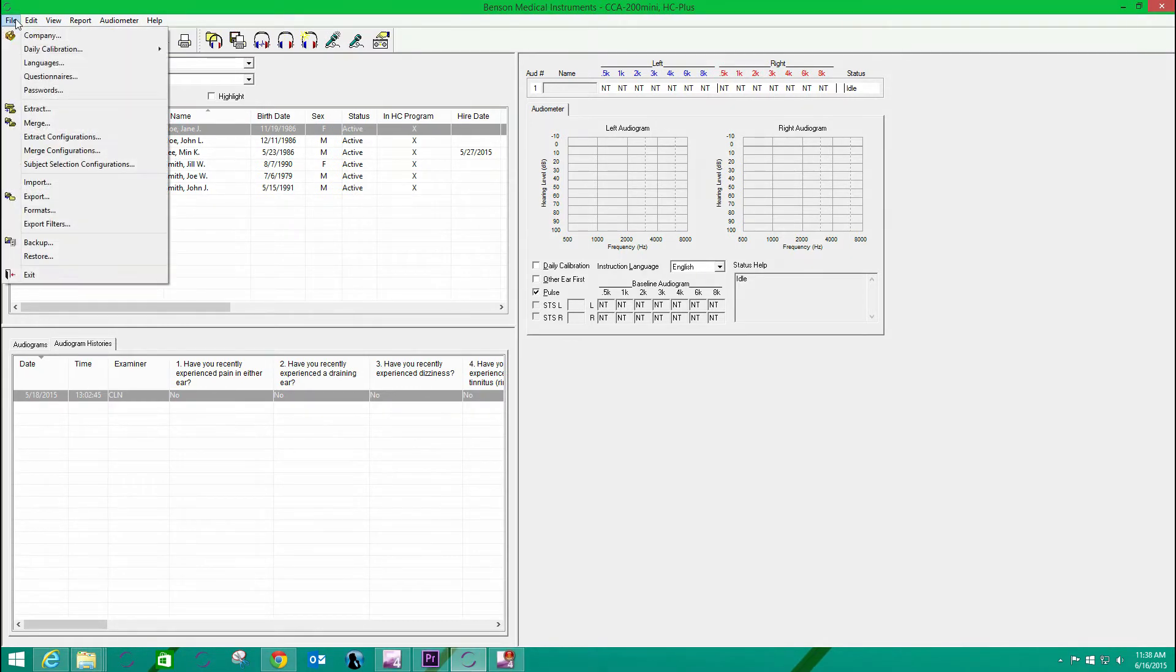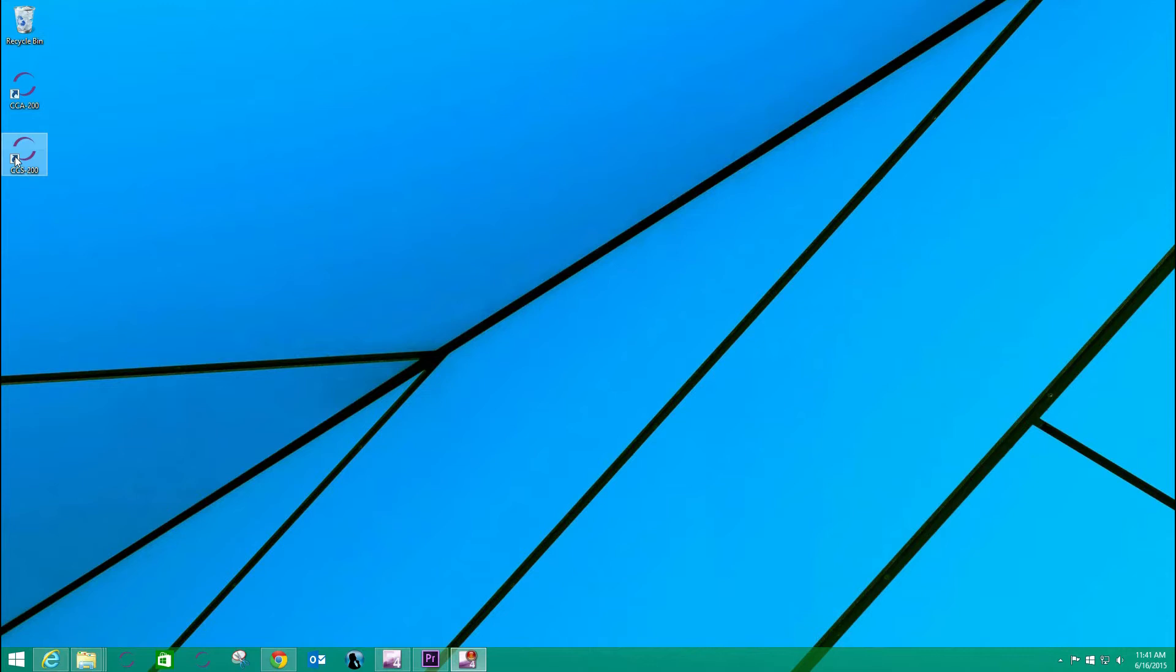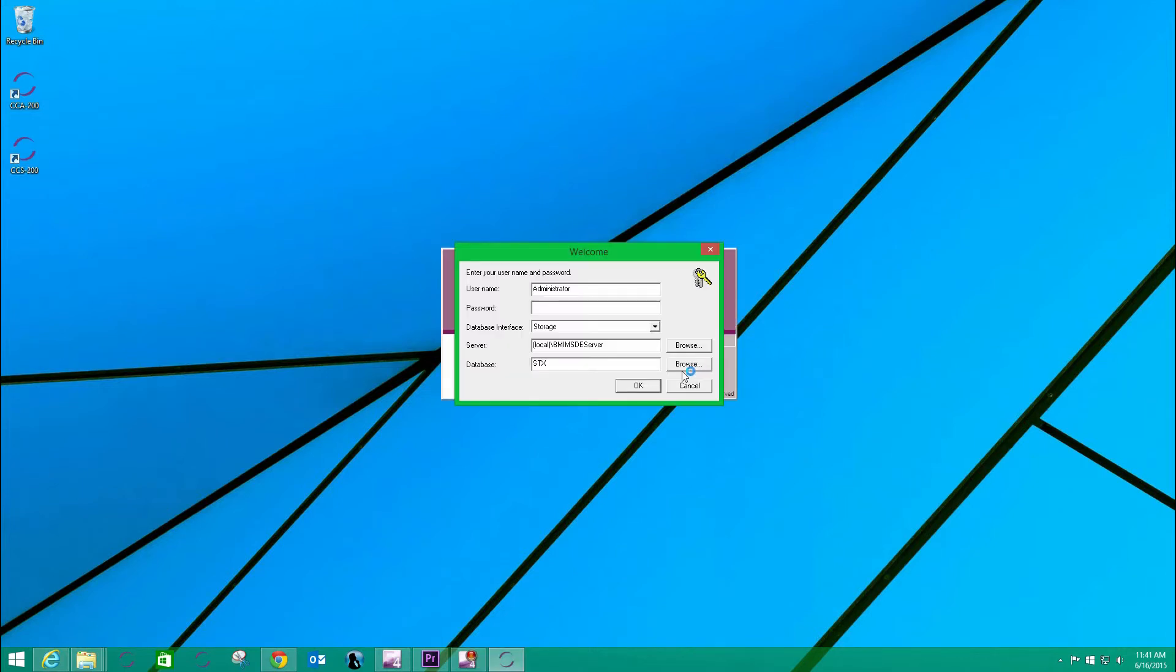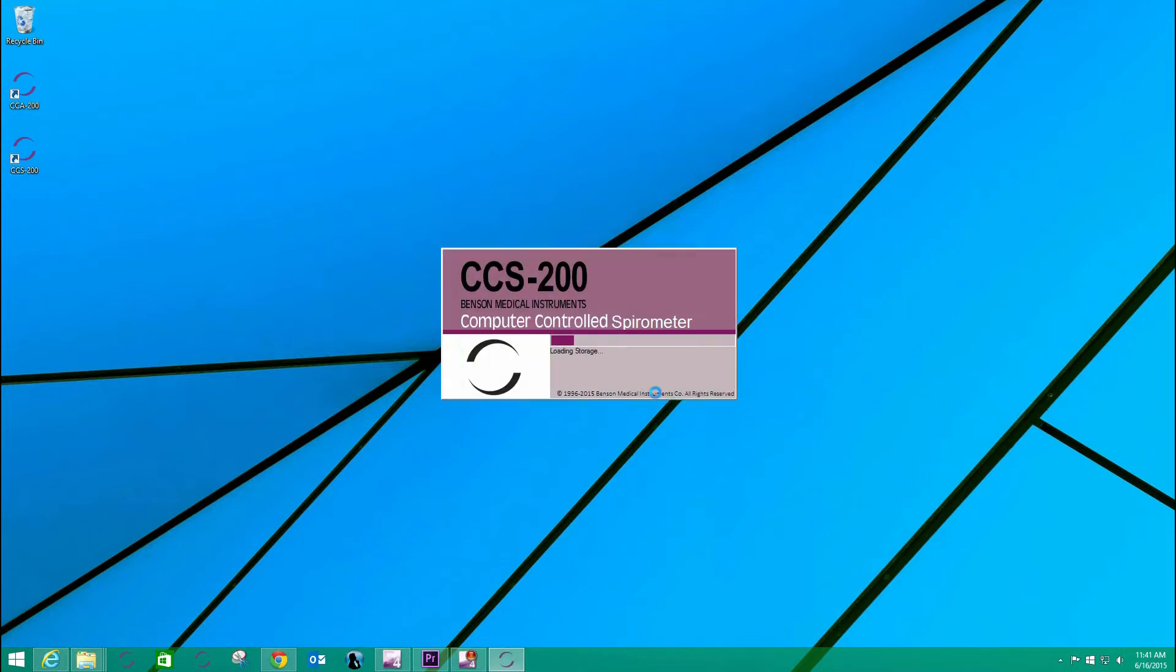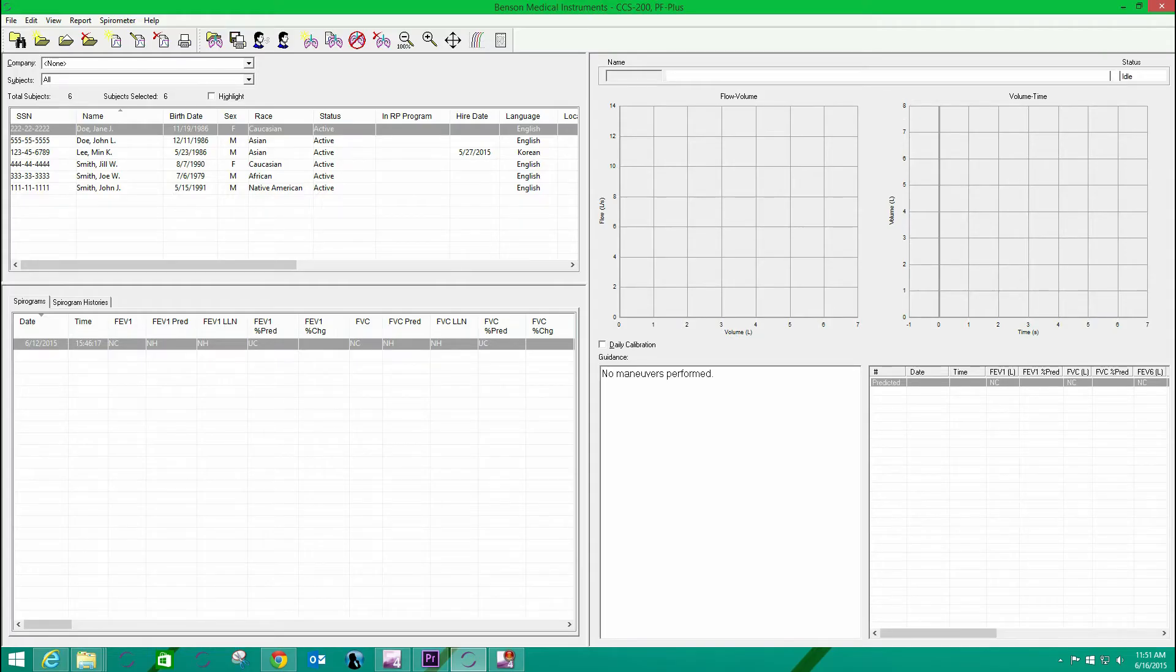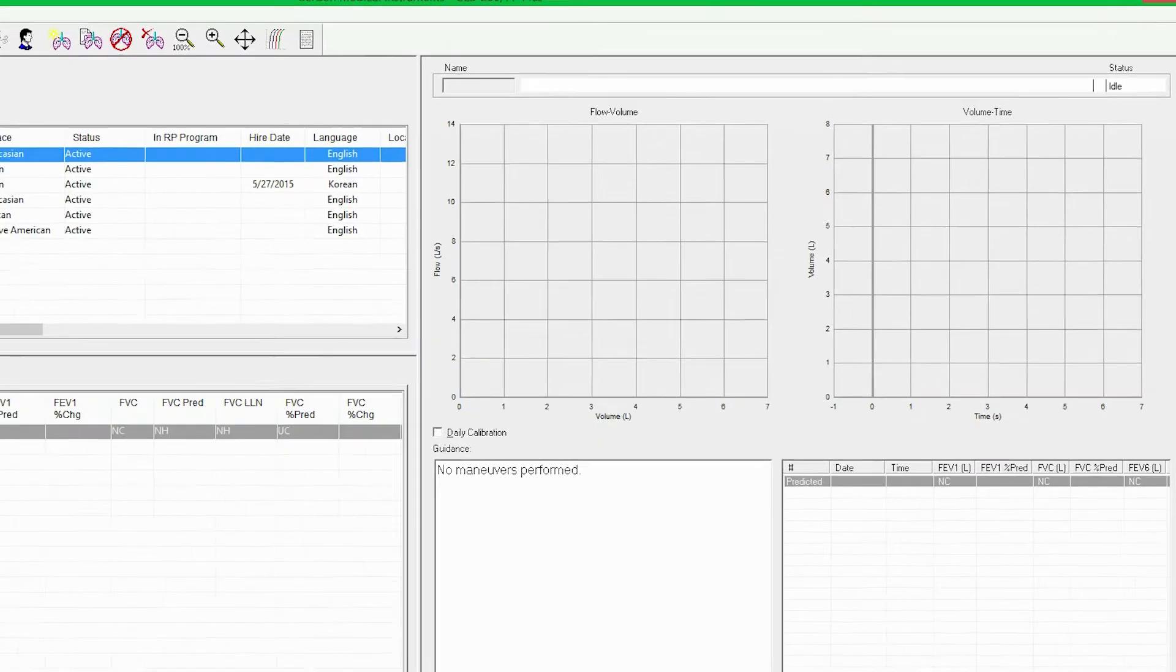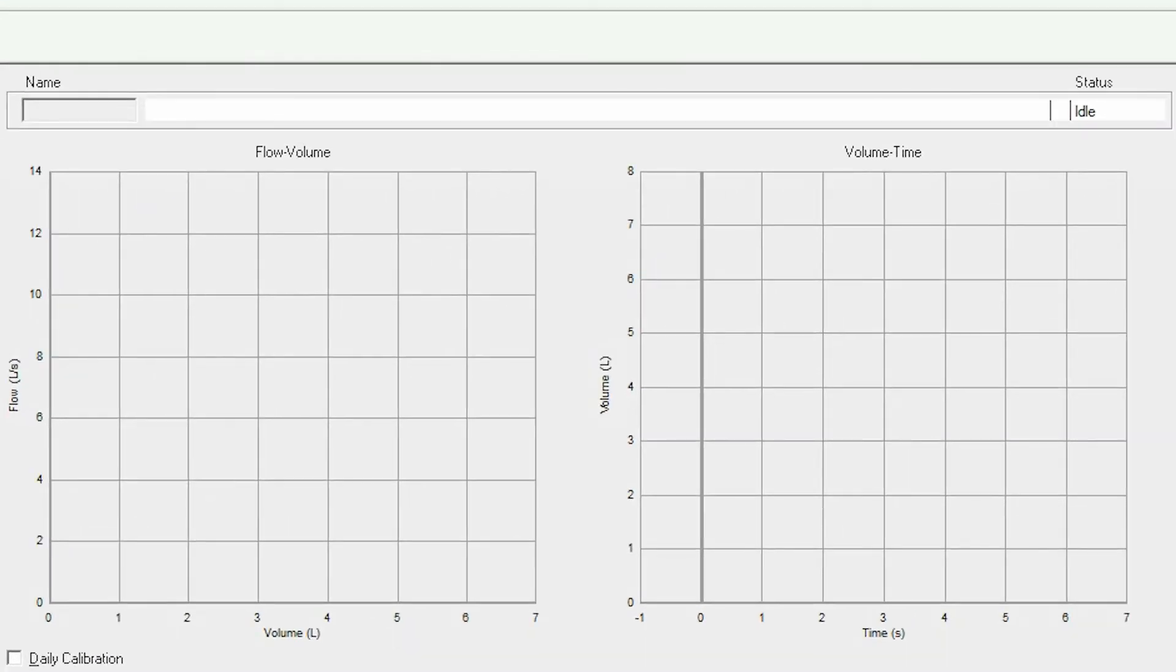I'll exit this program, and now click the CCS200 icon to launch the spirometer software. Note that the software is similarly arranged with the instrument control for the spirometer on the right and database view on the left, but now the spirograms are shown.